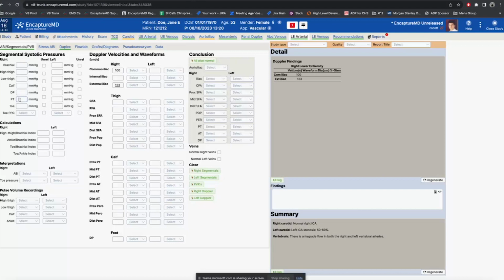If that ratio is out of whack, it's an indication that there is some degree of vascular abnormality on that side. It's a very quick, easy, relatively inexpensive test. But if it's negative, you're good. If it's positive, then you can immediately go on and do additional imaging, or you can schedule for a different time. So there's ankle brachial index, there's toe brachial index, so you can go even further down.